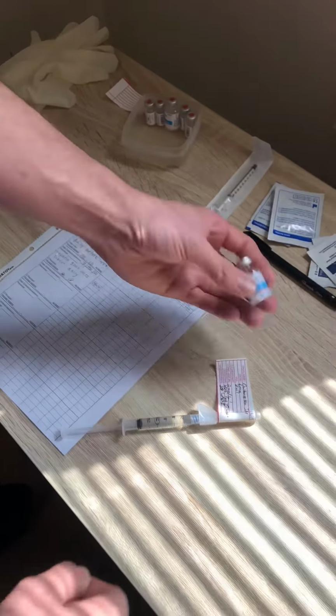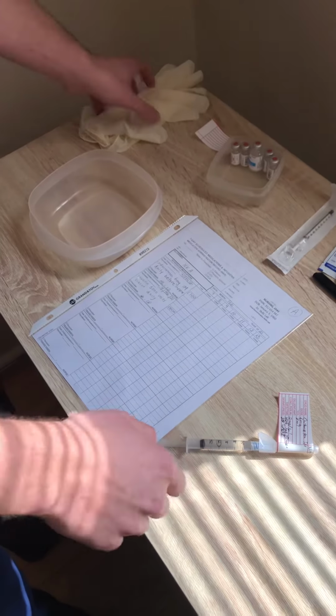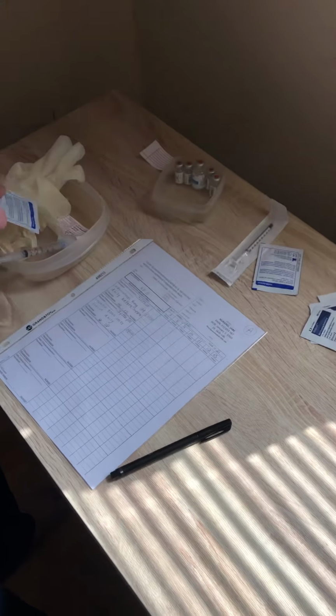Okay, so now I'm going to put the rest of this into the med waste. I'm going to gather up my supplies. So I'm going to get my gloves, this, my pen, grab a 2x2, grab an alcohol swab to clean the site with.